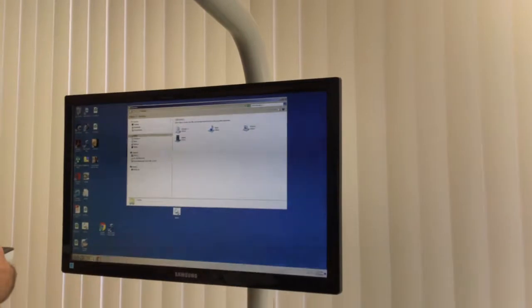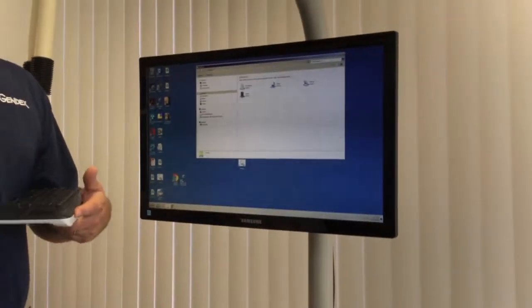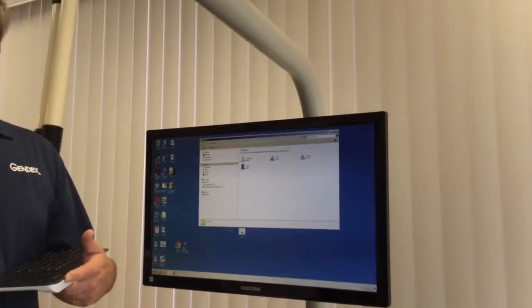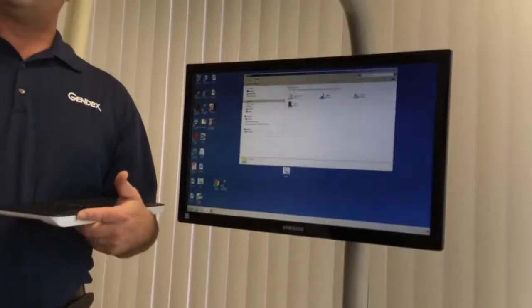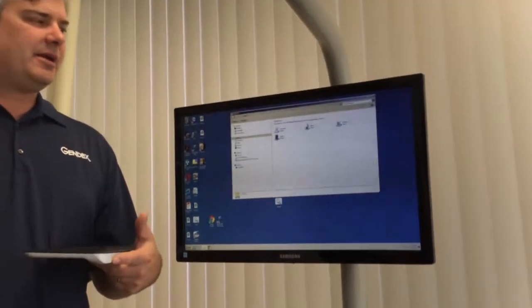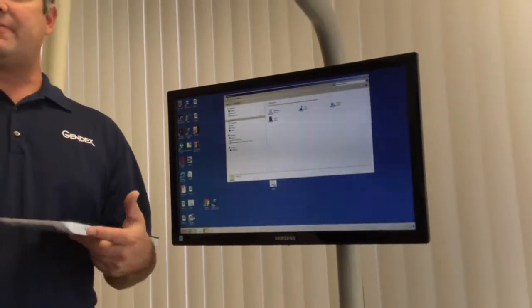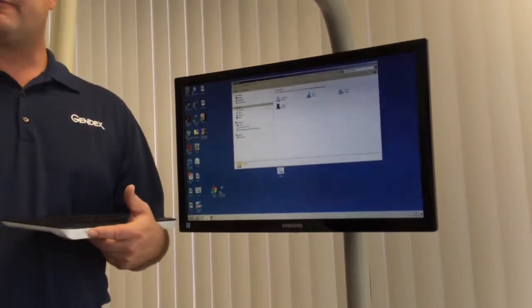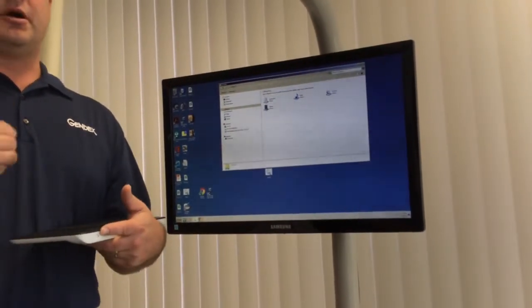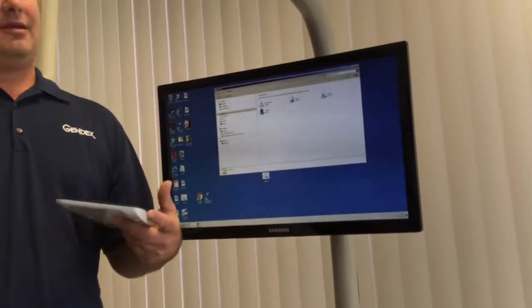Should we do it automatically? I mean, as soon as you're taking a CT scan, should we give it to the patient? It depends on you. Are you going to be charging for the cone beam scans, or are you just going to do scans to find more dentistry? I think charging. Yeah, it's totally how you want to view it. If they pay for the scan, are they buying the scan from you? Then you can give them a copy of the scan. If you're still going to own the scan, then maybe you don't want to give them a copy.